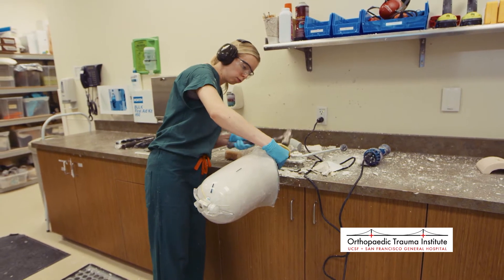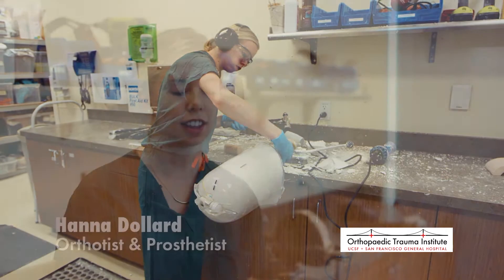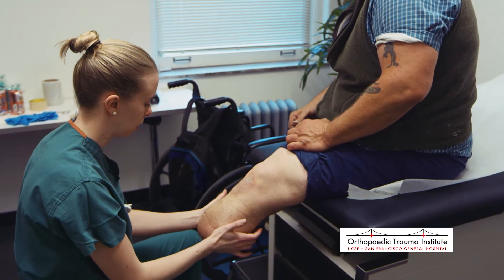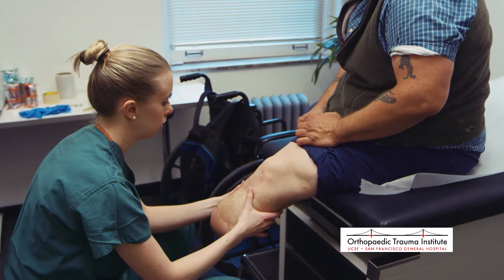The process of getting a prosthesis is lengthy, with the intention of it being that way. It's a whole re-education, so there are a couple of different steps. The first is the evaluation, which gives us an opportunity to see exactly what that person may need. Not everyone's the same — we have a choice of many different components, lots of different feet, and it's our job to decide which are best for you based on your needs.